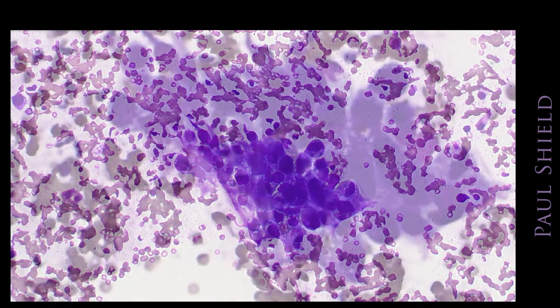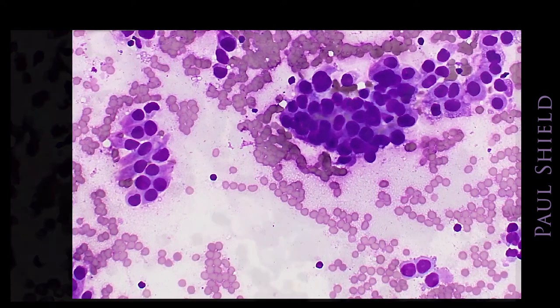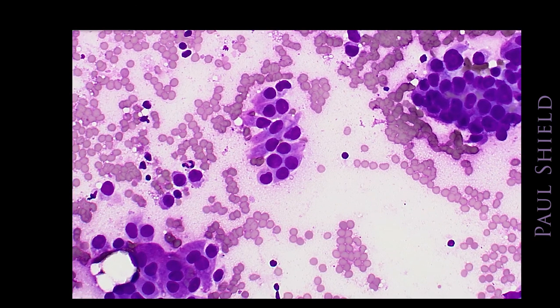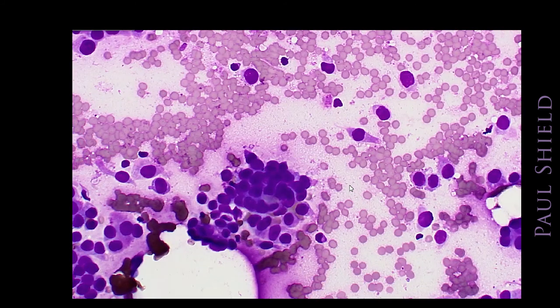Another example with some groups of cells. These ones are showing quite fine vacuolation on the Diff-Quik stain. You can see just little punched out clearings in the cytoplasm. And so this is more what I would call punctate vacuoles. Notice here you can see the columnar shape to the cells as well. So that small little group, you can see the long polarized nuclei and the long tails of cytoplasm on these.